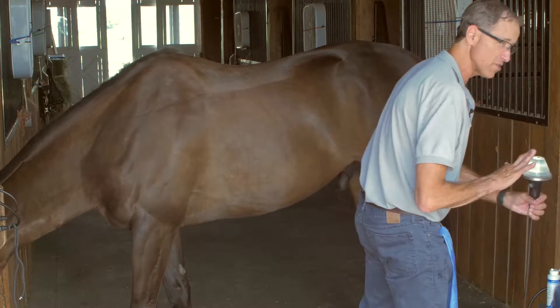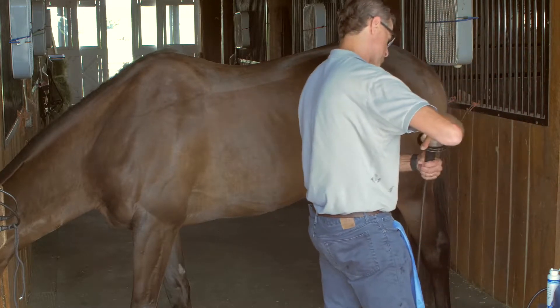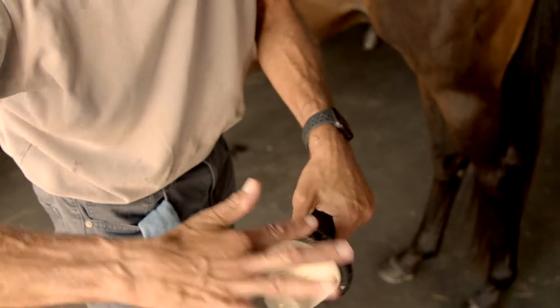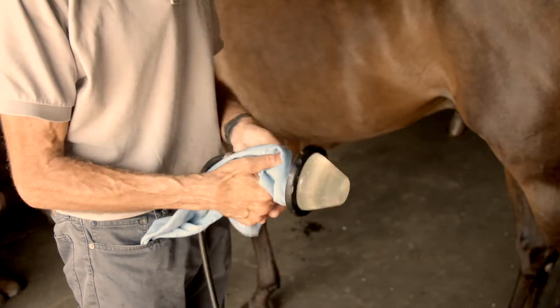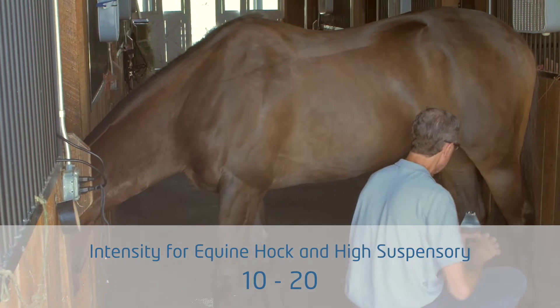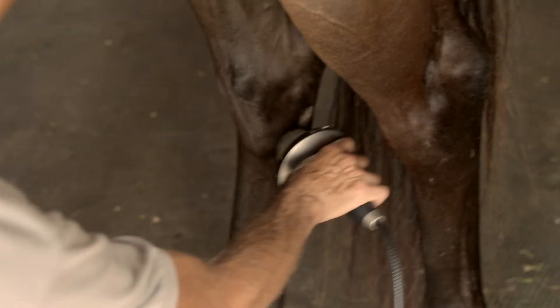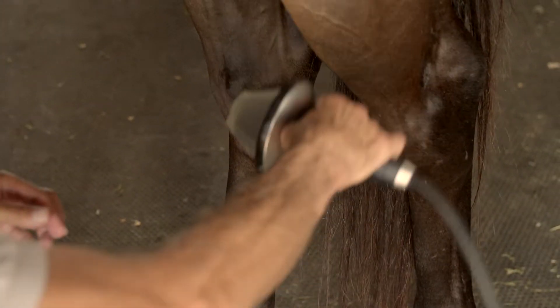You don't want any gel coming around the edge because that's going to make the locking part not work very well. Check to make sure none of the gel is coming out and you have a good seal — really good contact. Even though he's tranquilized, I'm going to drop the power to 10 and work back up. Note the orientation: if I'm treating like this, I'm not going to reach the insertion of the high suspensory.